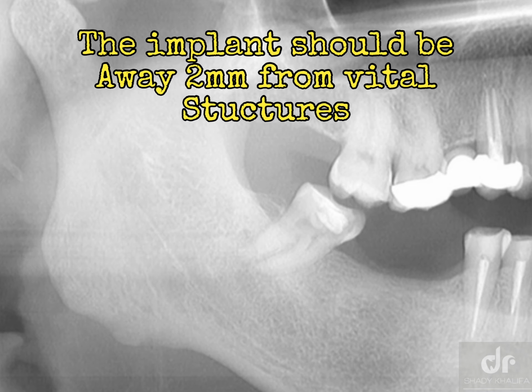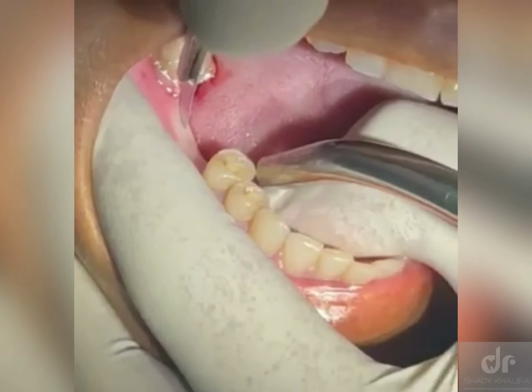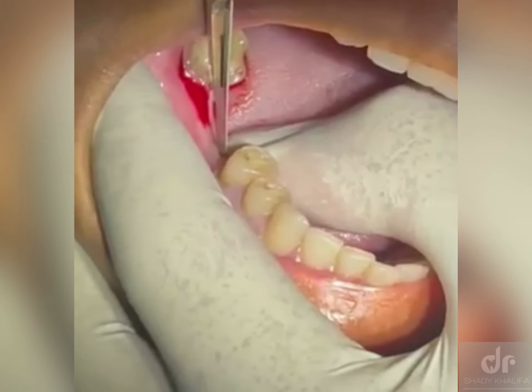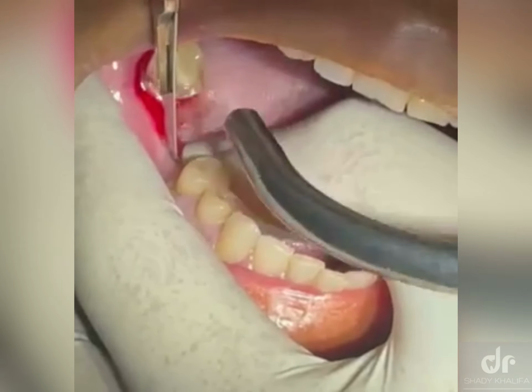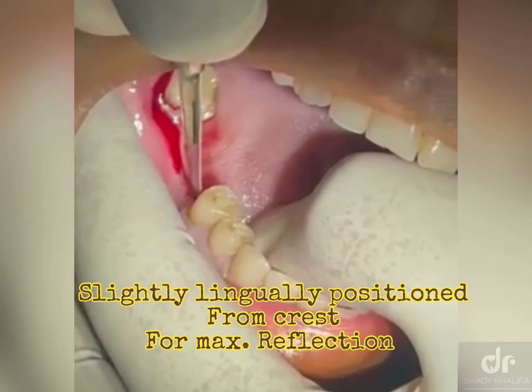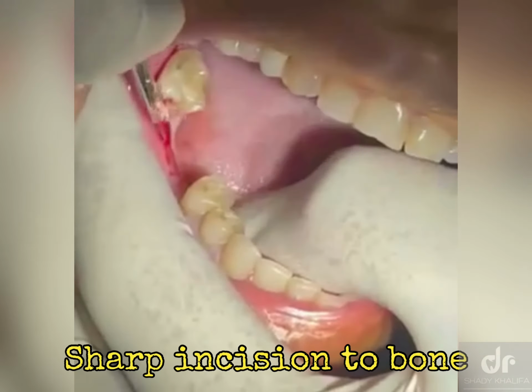We will talk later, inshallah, about the exact measurements that we should know for the implant site. As we see here, the incision started. I like to take the incision a little bit lingually, to get maximum reflection of the buccal and the crestal side without impingement or hiding from the lingual tissue.